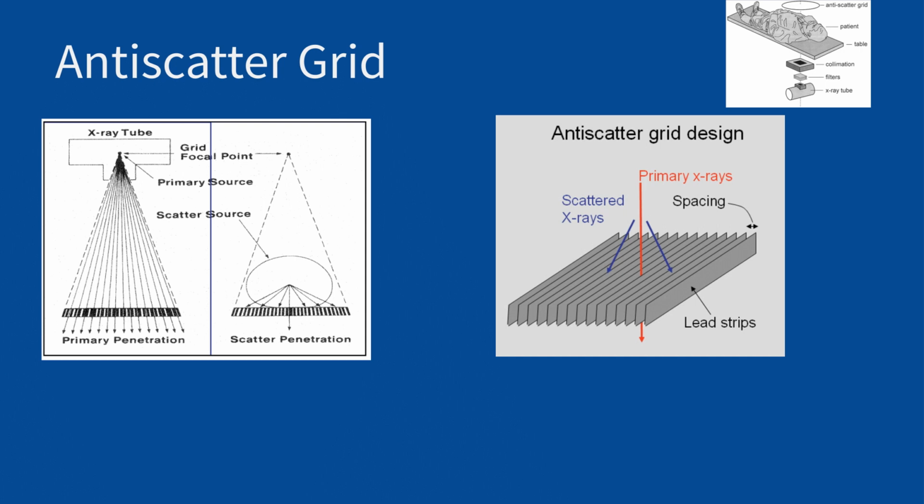So we have now these great X-rays that pass through the filter. We only get the best quality of the X-rays. We make sure that we collimate as much as possible and really only let through X-rays to the areas that we care about, allowing us to reduce scatter. Now the X-rays hit the patient, yet there's still scatter. We cannot completely eliminate scatter because again, scatter is required in order for us to have enough interaction to actually get X-rays that we can use in the image generation.